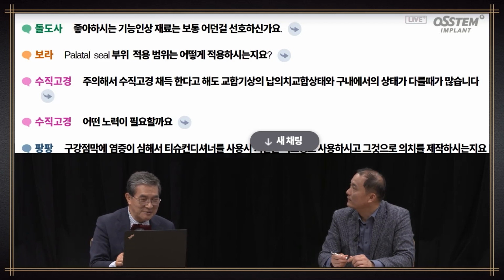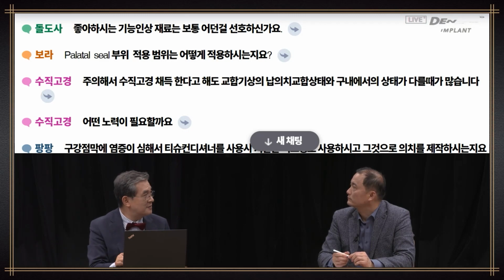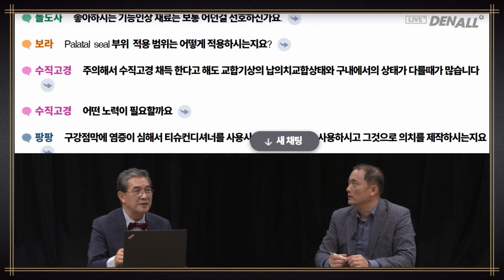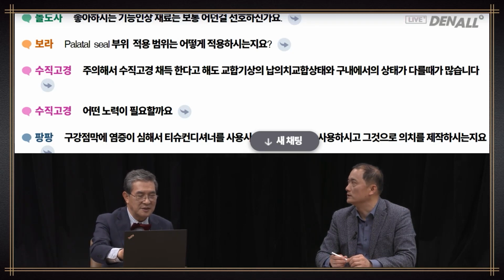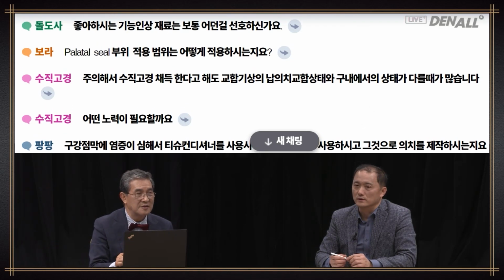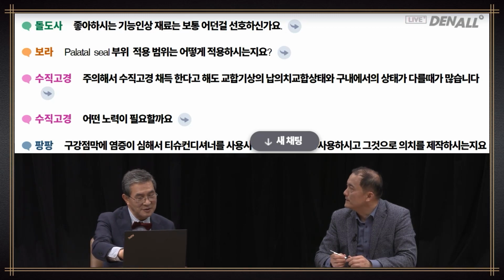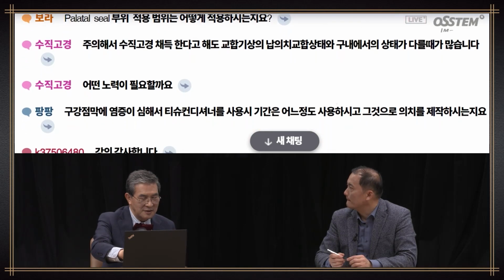But anyway, the next question says, which kind of functional impression material do you prefer? Well, for me, PVS or rubber materials. That is the first I use. But if it's a challenging case, tissue conditioner or fit checker are used for dynamic impression taking. And then the palatal seal area, how do you apply that? I think the vibrating line is what you use. Probably you have already explained.